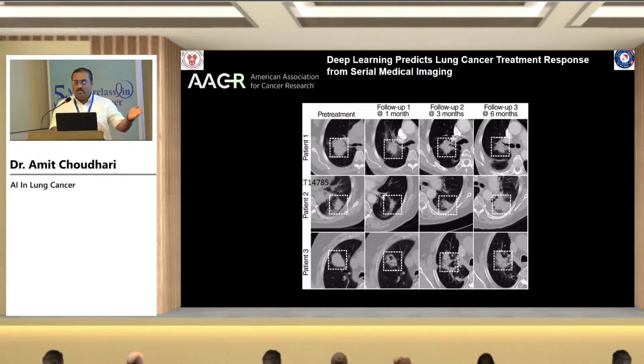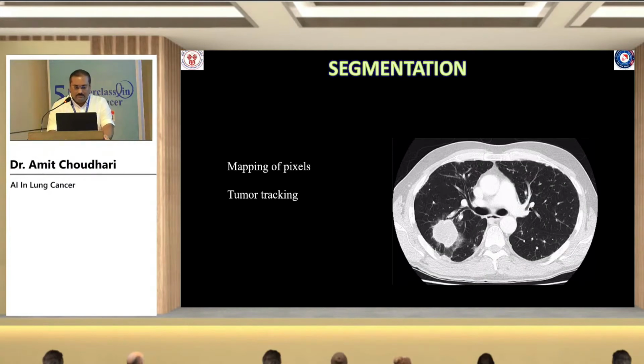And its importance has already been emphasized in the previous talk by the earlier speaker as to why we need to measure and give those measurements as far as whether there is progressive disease, whether there is partial response, or whether there is complete response.